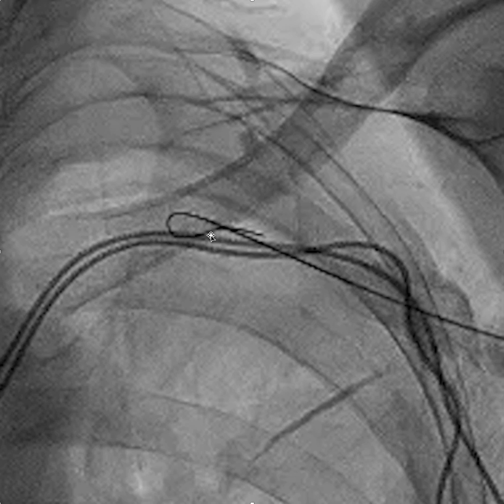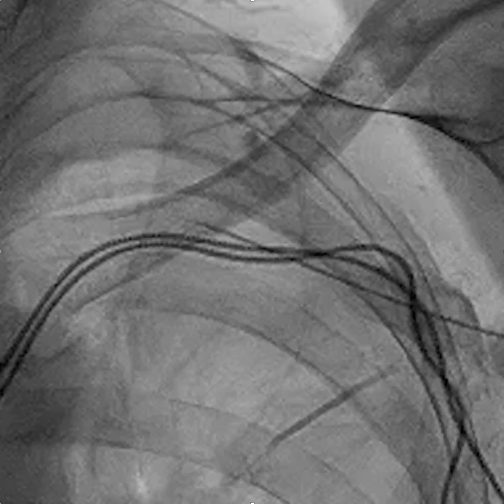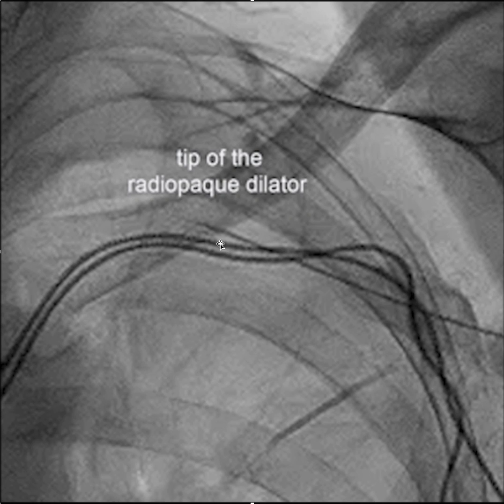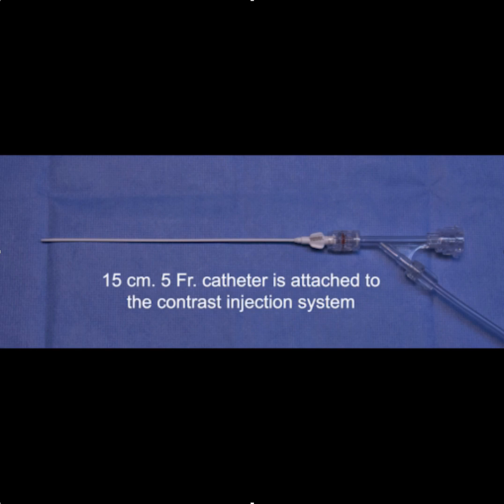Once you get to this point, you don't want to jam the dilator any further because it will disrupt the anatomy and make it more difficult to cross. Gently advance to that point, then withdraw the wire — you can still see the tip of the radiopaque dilator. Once the radiopaque dilator is removed and only the 5 French outside diameter catheter remains, you can't see it.